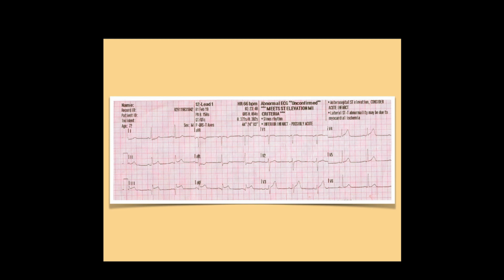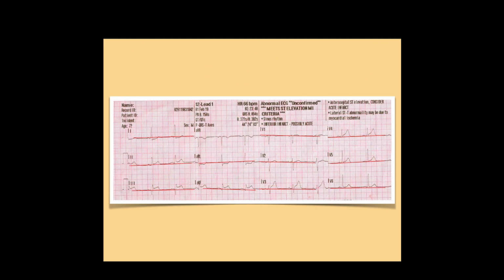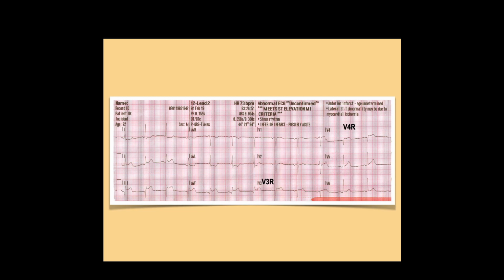Again, here we have our criteria for, do I put down? Yeah, I did put down. Oops, excuse me. So we've got ST elevation in 3 and aVF, reciprocal changes in aVL, T-wave abnormality in 1. In this particular case, the paramedics moved V4 over. I don't know how they printed that, to be honest. I've always just written it. Maybe they had a nice little stamp. I don't know. Anyway, V4R, they printed it on.